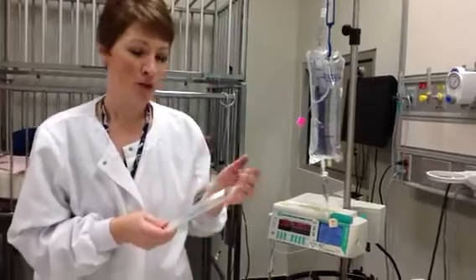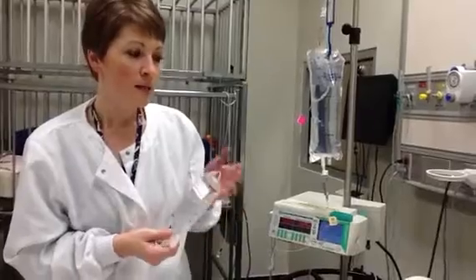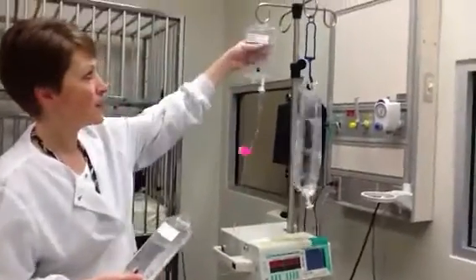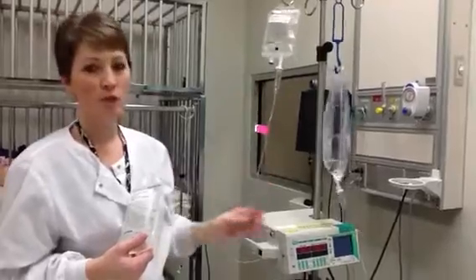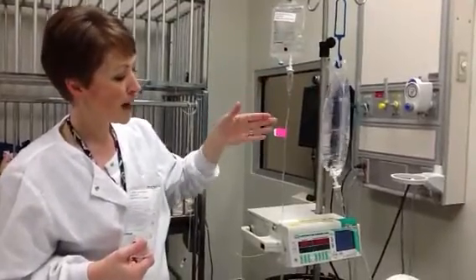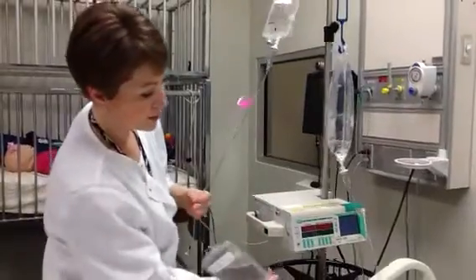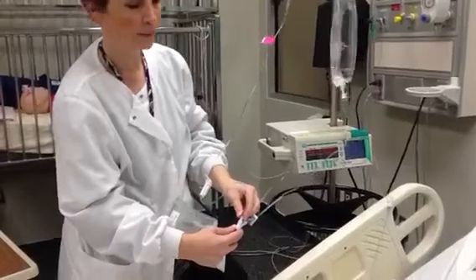So this is going to be part 2 of doing a secondary IV piggyback or an antibiotic. Sometimes you come into the patient's room and they already have an IV piggyback bag hanging because some antibiotics are ordered every 8 hours. So the tubing doesn't have to be changed every 8 hours, so you're going to see an empty bag already hanging in the room. And so this part I want to just show you how we can change this bag over without actually disconnecting it from the primary tubing.